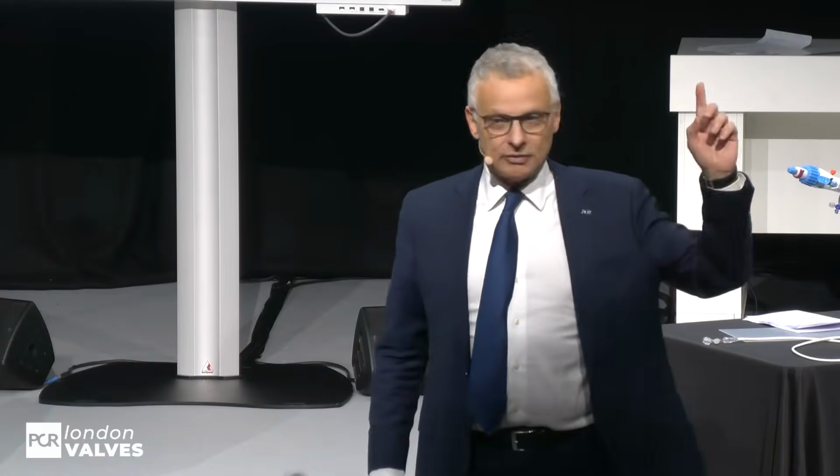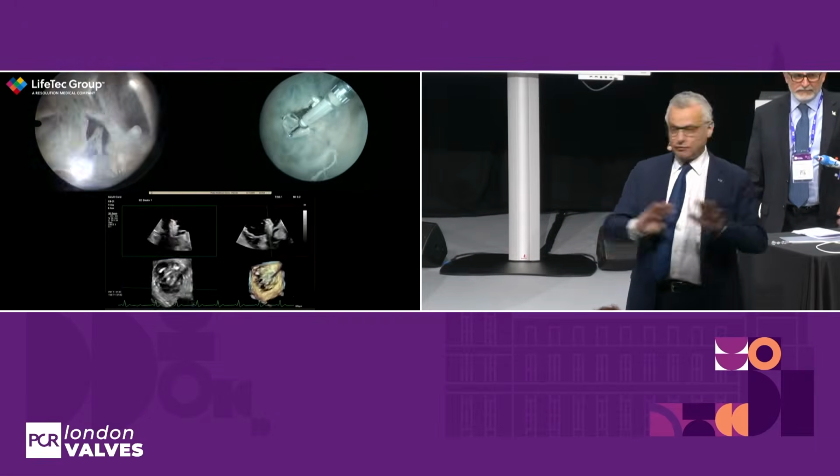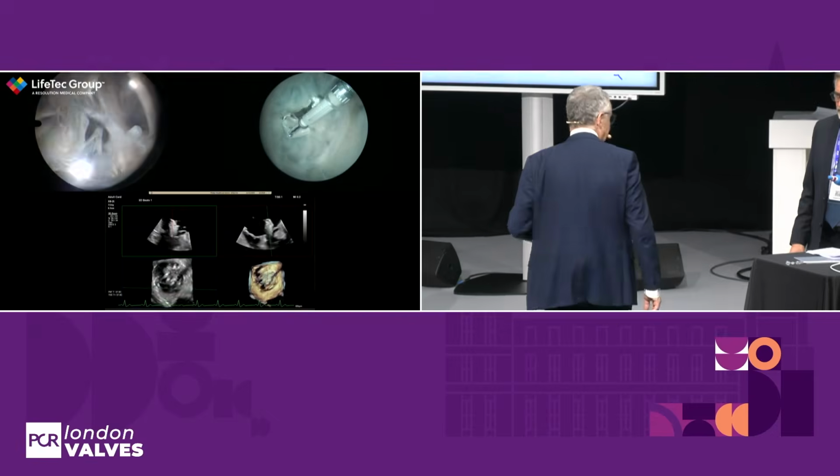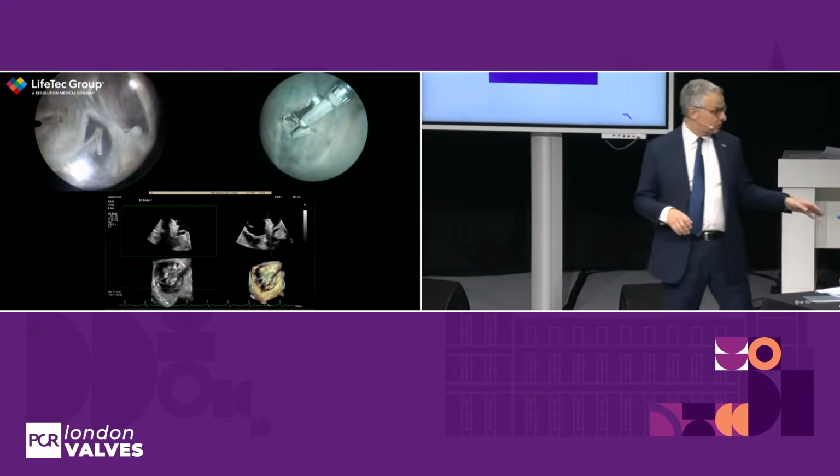So who would vote for anteroseptal only? Who would go for both antero and posterior? So 50-50, I love it. Great. That's the confusion we have. And that's what I think we should clarify.